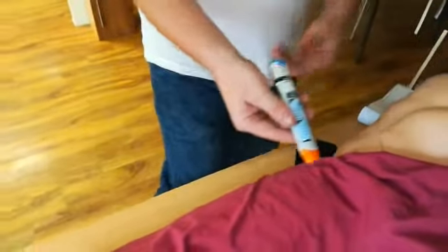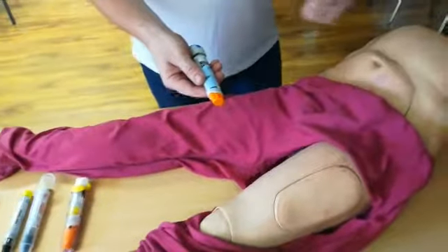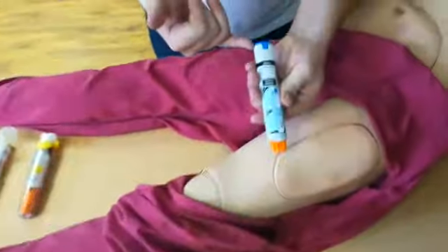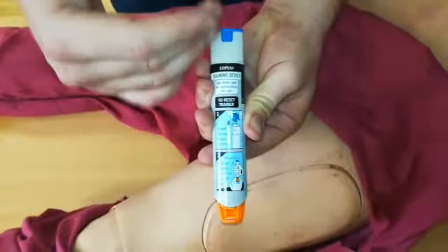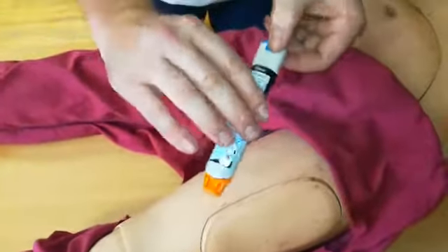Bear in mind that for an adult we've only got 0.3 milligrams in it, and for a child it's 0.15 milligrams, so there's not much there. Looking at where the safety cap is, we're identifying where the needle is going to come out. We shouldn't be putting our finger across, because bear in mind this is only plastic with a large needle. We need to make sure we are set.